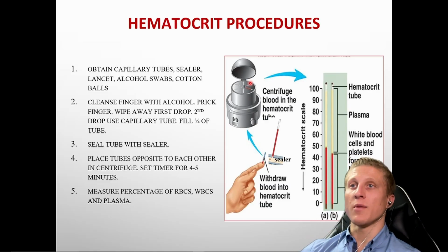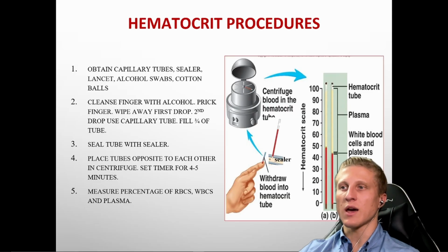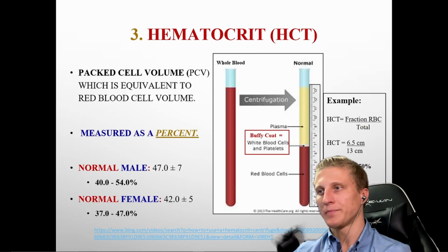So the formed elements of our blood, our blood cells, are going to collect down here at the bottom of this vial. And then everything that's light, such as water and the solutes, think of our salts and our proteins, are going to float up here in the plasma. Okay. And so this is a way that you can calculate hematocrit, just taking that proportion that we mentioned right here with this calculation over on the side.